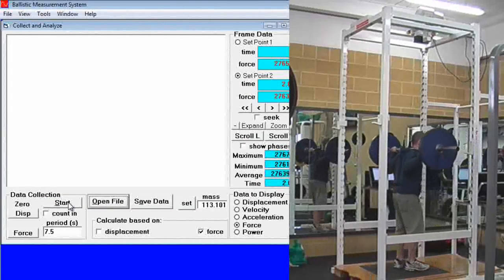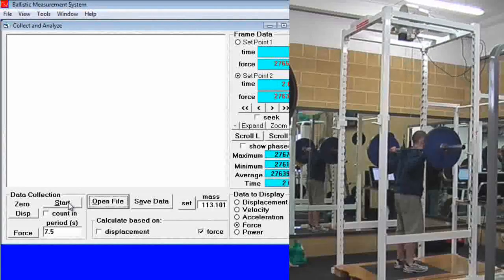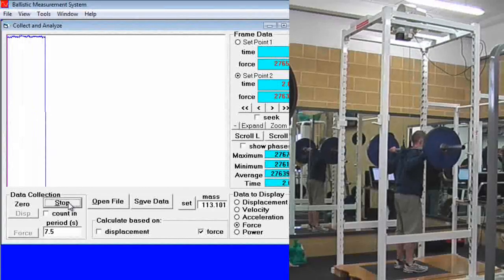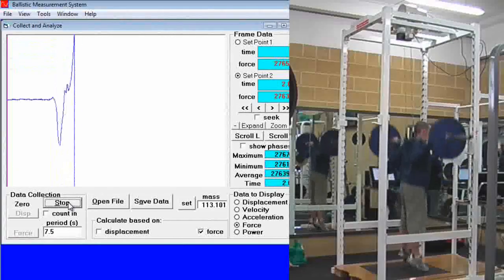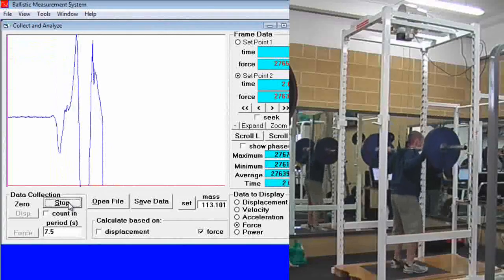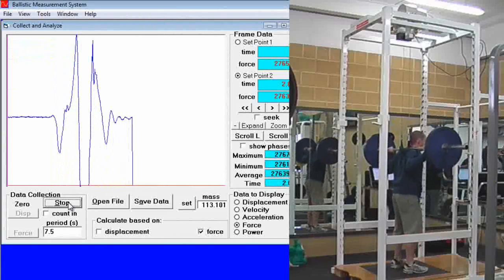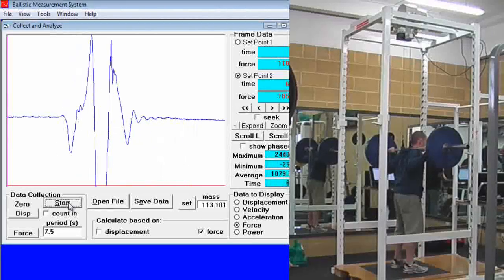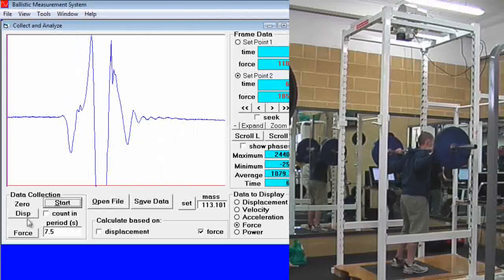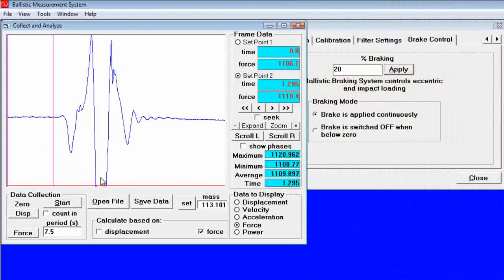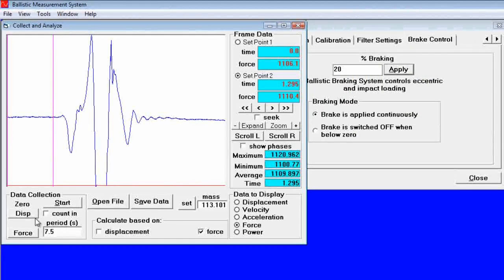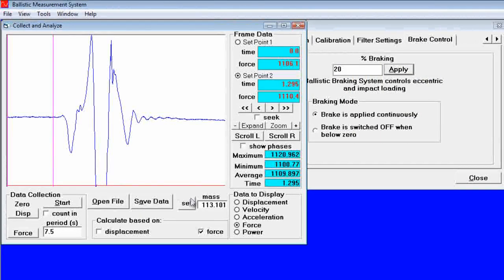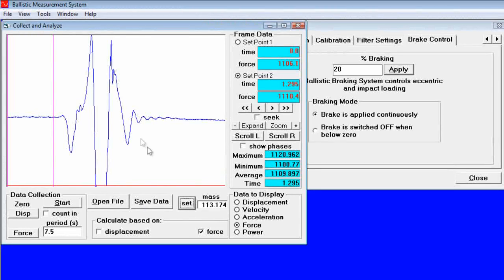Once he is in position, we can click start and have him perform the exercise. Then once again go in and set the system mass. Click on the set button.